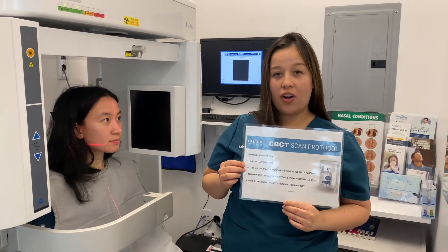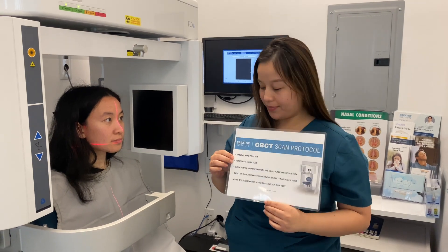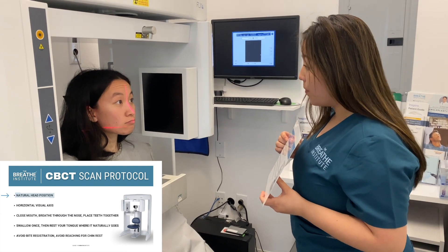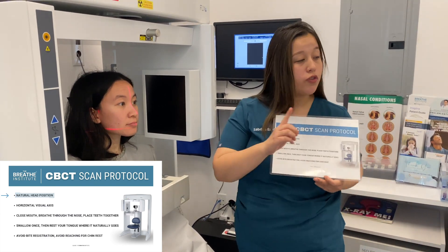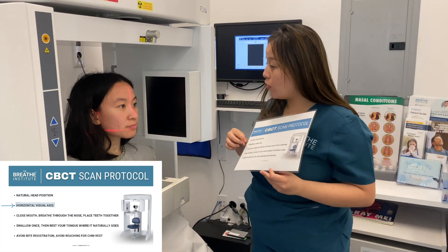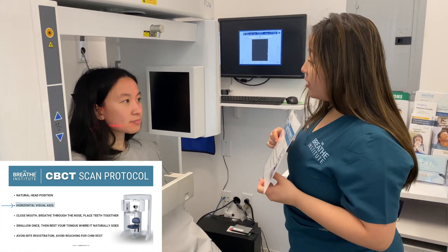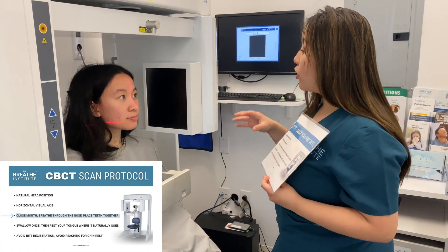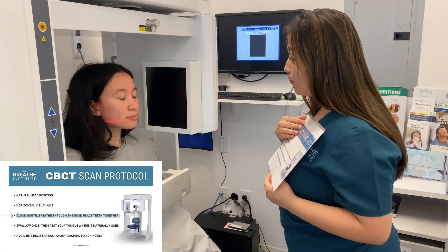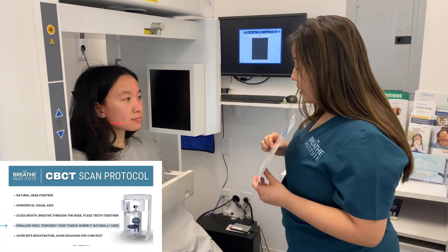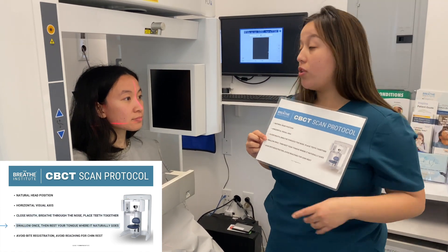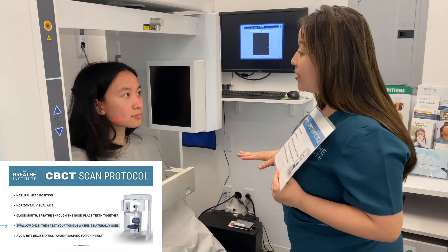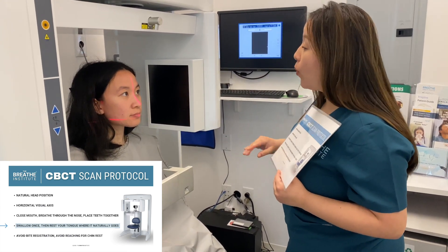We will now instruct our patient on our CT scan protocols. Okay Sam, during the scan you want to make sure you keep your head in natural head position. What you're going to want to do is look at yourself straight into the mirror and make sure you do not move during the scan. In addition to that, we want you to breathe exclusively through your nose. What that means is that your lips are going to be sealed and your teeth will be placed together. Lastly, when you go to the scanner, I will instruct you to swallow once and then just allow your tongue to rest in its natural resting posture throughout the whole scan.